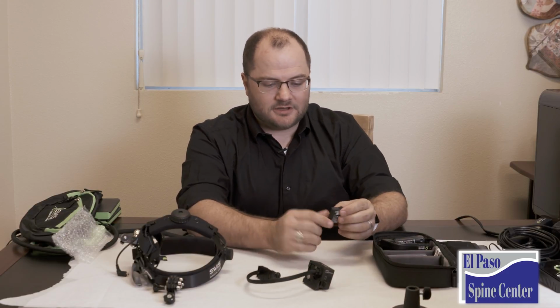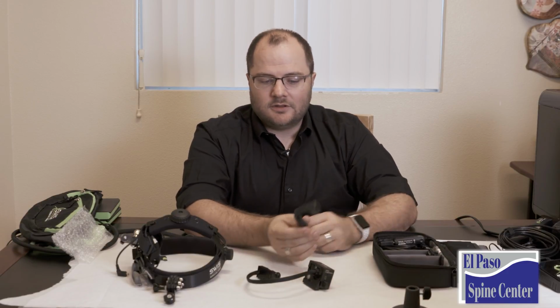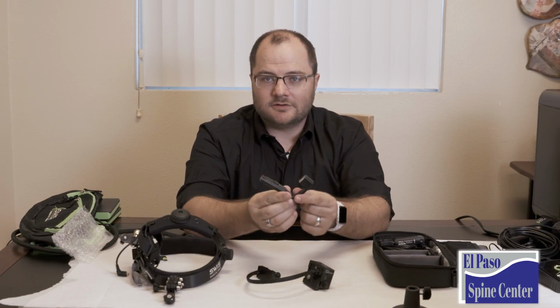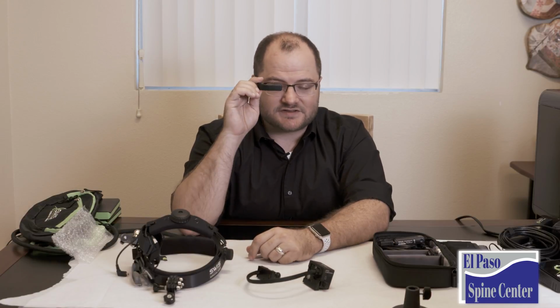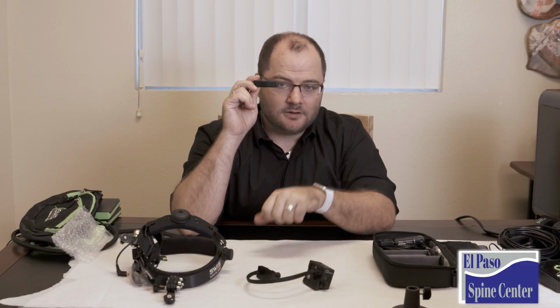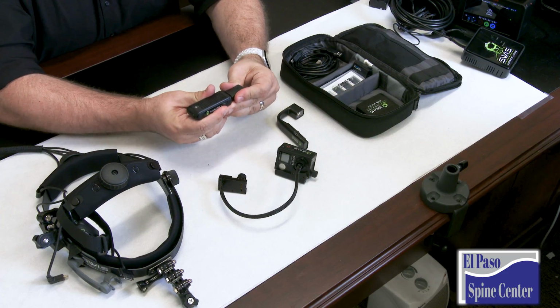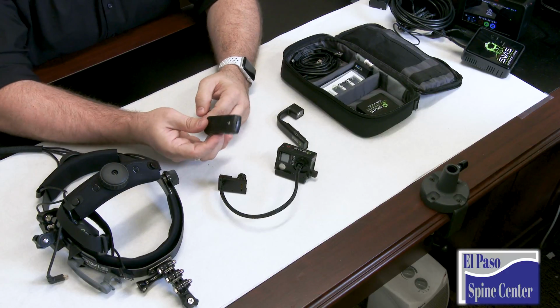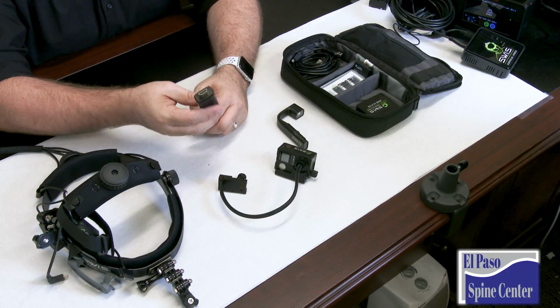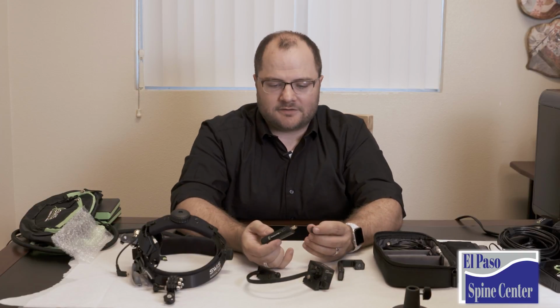It does come with a battery, but we're not going to be using it because we're going to be running through the power supply. You do have this little, looks like an L-shaped device. This is actually the viewfinder, so you can see what you're recording during the surgery. It's a really cool HDMI wireless transmitter. This is what actually gets the signal from your GoPro into the wireless system. But we'll come back to that in just a minute.